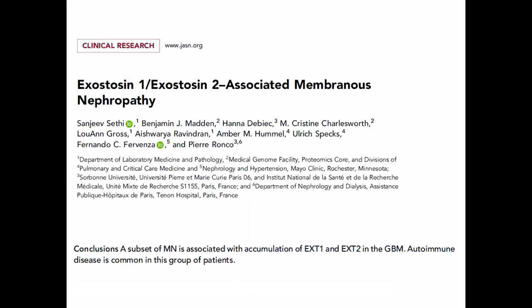So in this case also, on kappa lambda we can label this as monoclonal gammopathy with dysproteinemia because there is light chain restriction. But if you do IgG subclasses also in these cases, you are very sure, because in an MGRS case or in a dysproteinemia, you are going to find only one subclass. It is not going to happen that you see IgG1 and IgG3. There will be only one subclass which will be positive. So this is an IgG3 kappa restricted membranous.